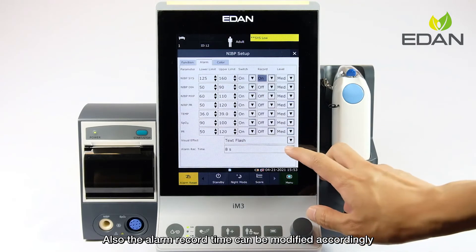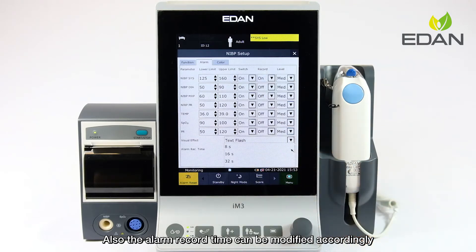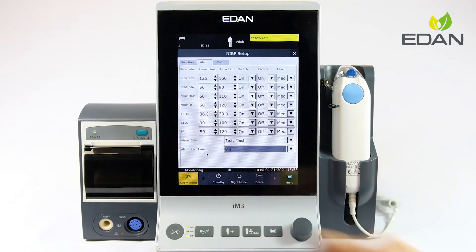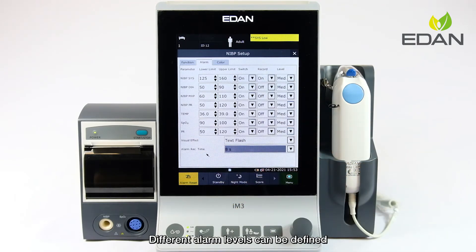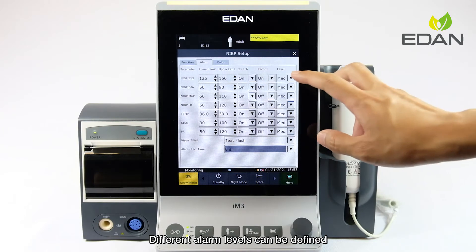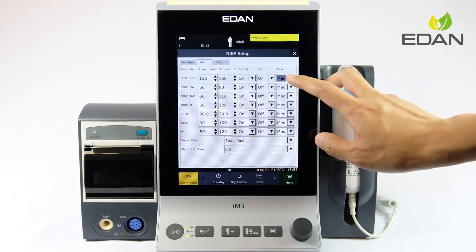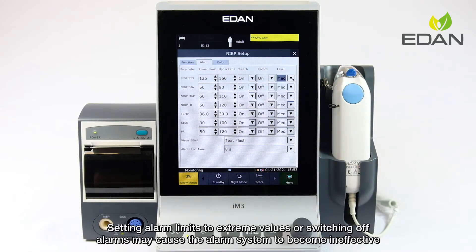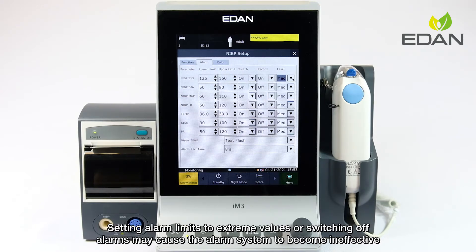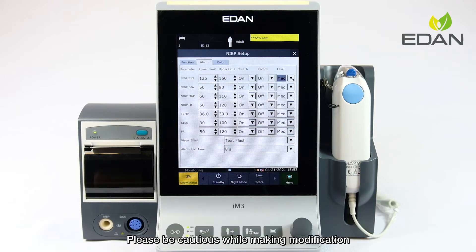Also, the alarm record time can be modified accordingly. Different alarm levels can be defined. Setting alarm limits to extreme values or switching off alarms may cause the alarm system to become ineffective. Please be cautious while making modifications.